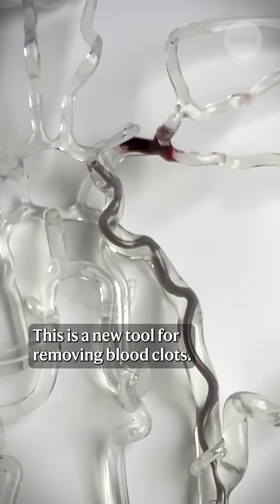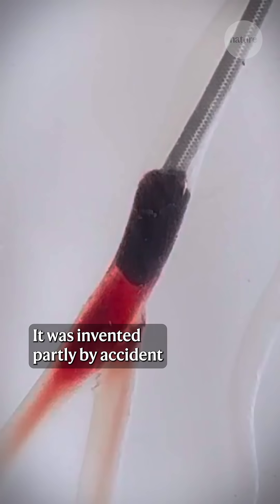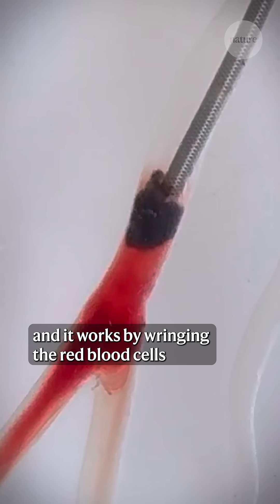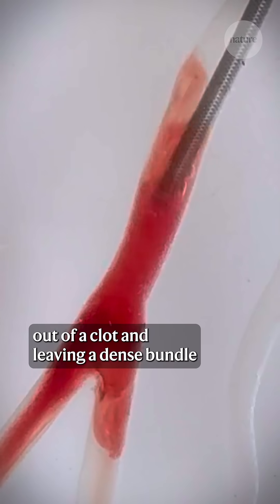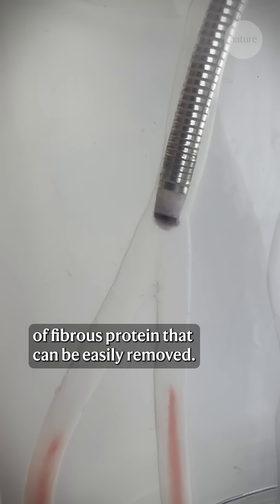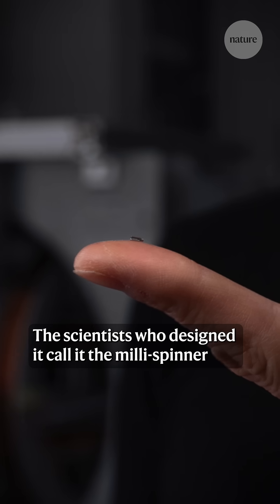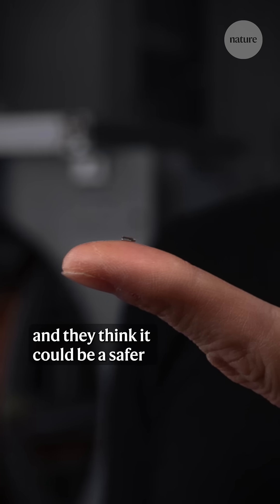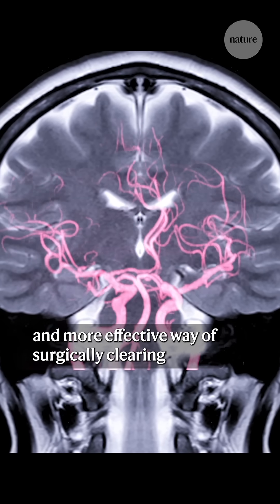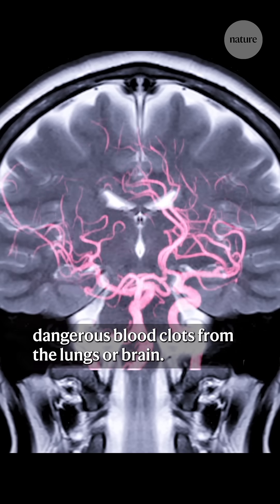This is a new tool for removing blood clots. It was invented partly by accident and it works by wringing the red blood cells out of a clot and leaving a dense bundle of fibrous protein that can be easily removed. The scientists who designed it call it the millispinner and they think it could be a safer and more effective way of surgically clearing dangerous blood clots from the lungs or brain.